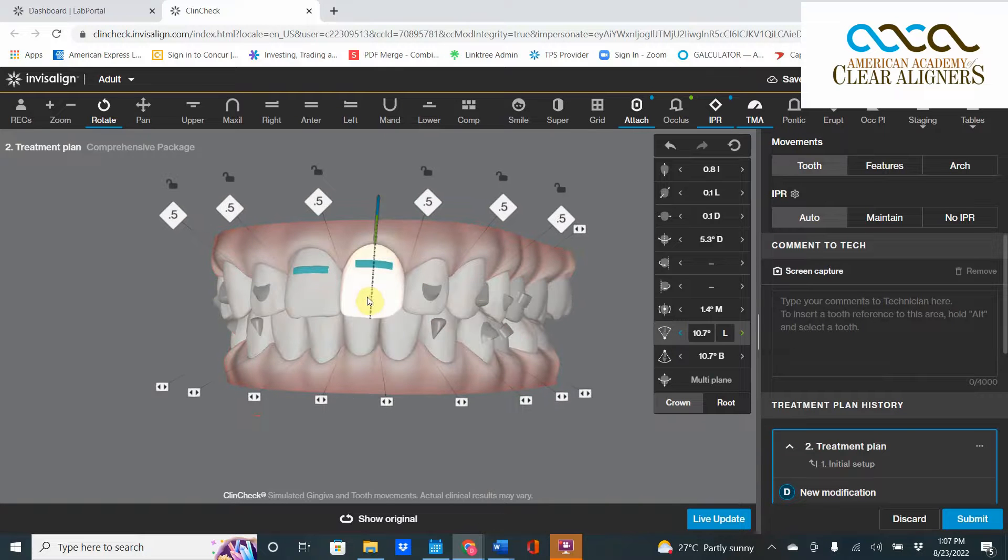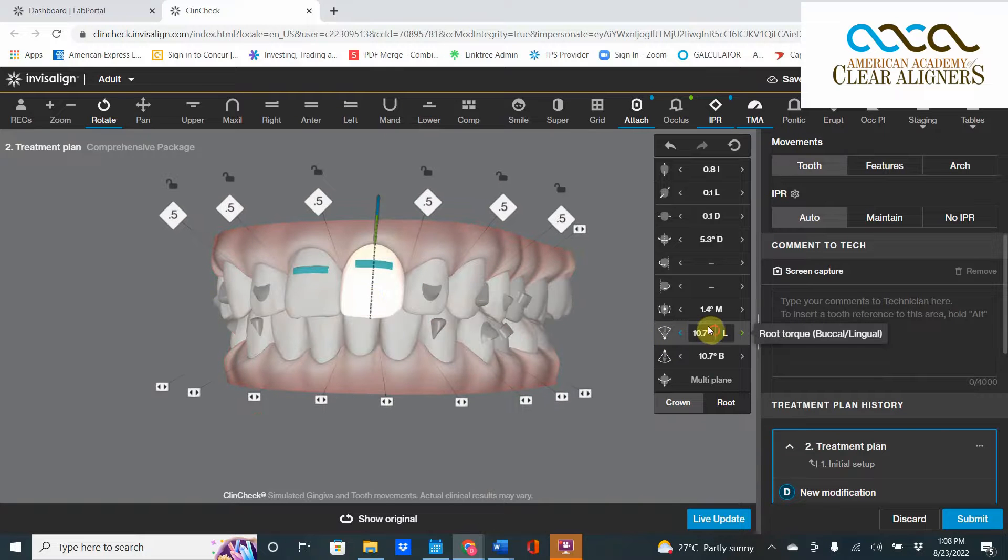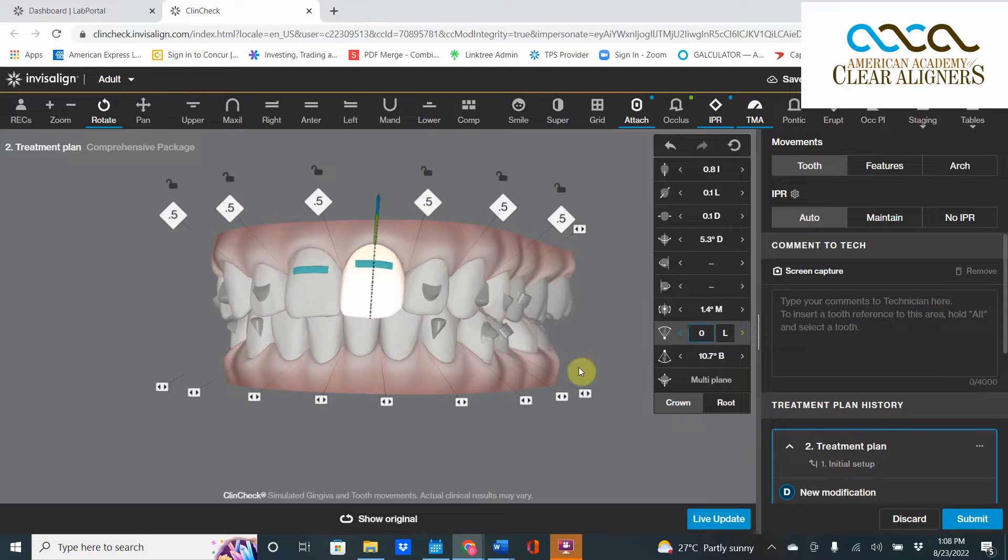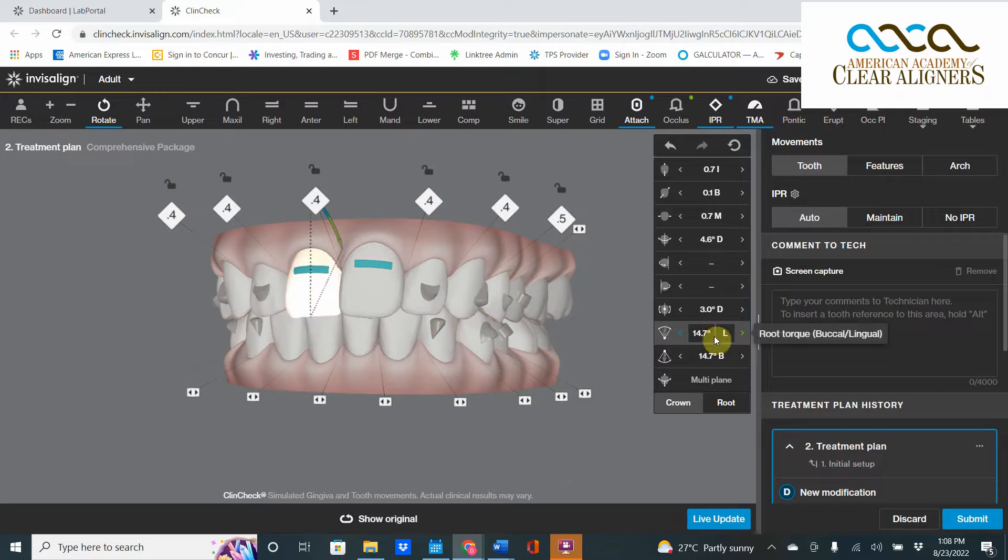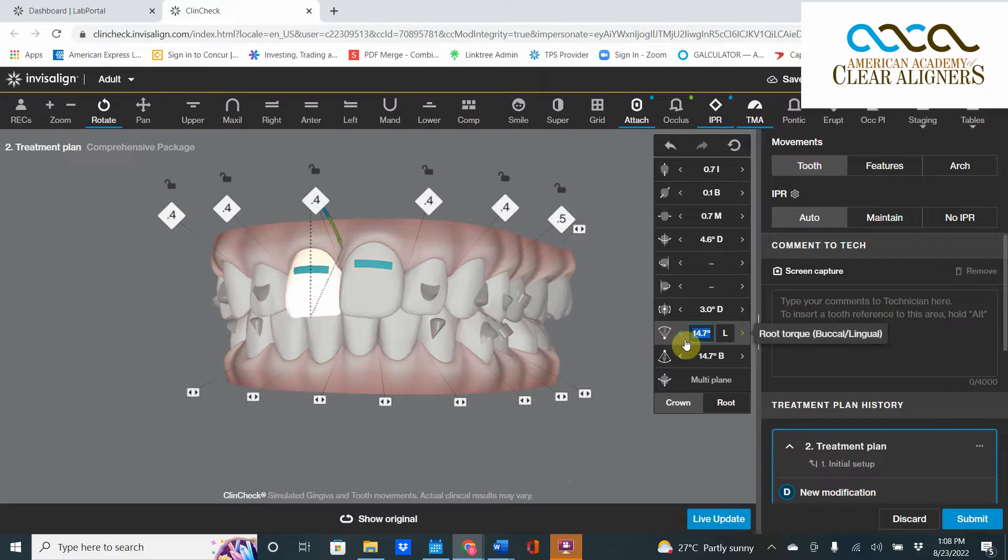I'm going to set that to zero. I don't want root torque. I'm going to take this one and set you to zero as well. All these central incisors and lateral incisors we're going to set to zero.